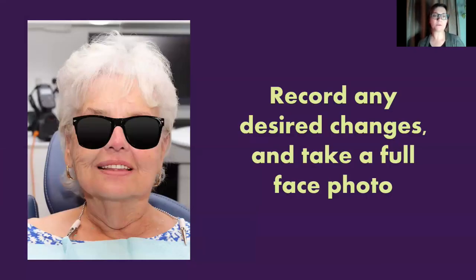With that impression material in, stabilizing the denture, take your full face photo. This is going to be your orientation record so that you can pull it into the design software and really get a nice smile design customized for your patient. If you take the photo before you put the impression material in, again, you might shift that midline, shift the incisal plane, shift the gingival display, and that can affect the design that you do with your dental technician. So do your wash impression first, stabilize that base, and get your full face photo.